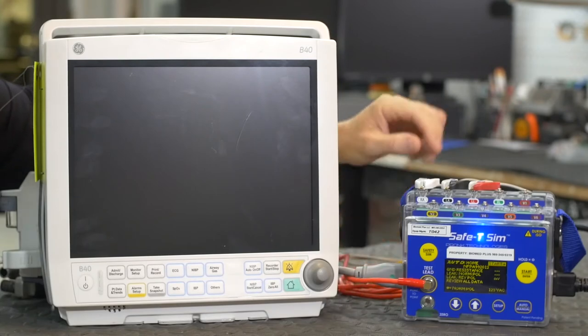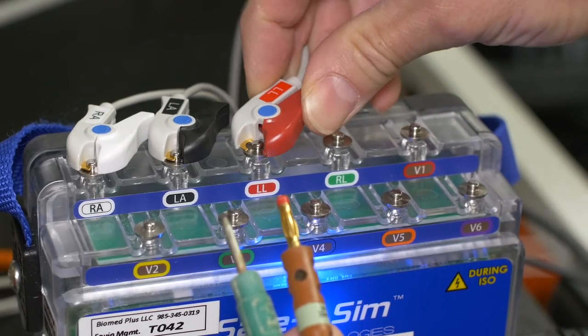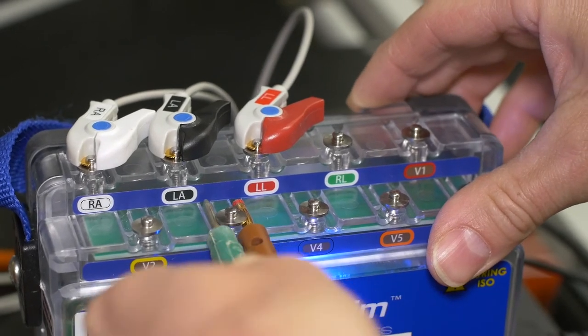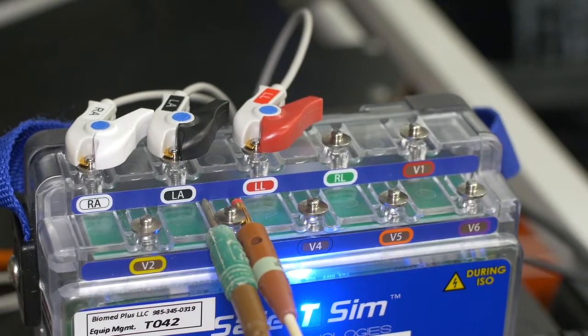Connect your Kelvin cable and leads or applied parts. You'll notice the ability to insert the banana plugs, both the old style and the new style, underneath the snap. Makes it easy and convenient.